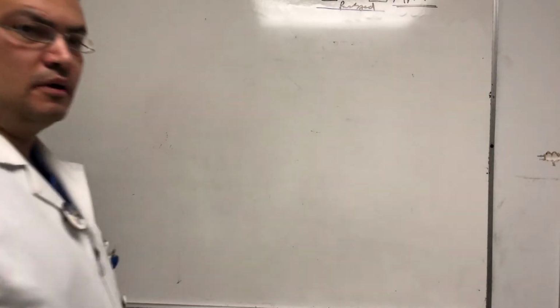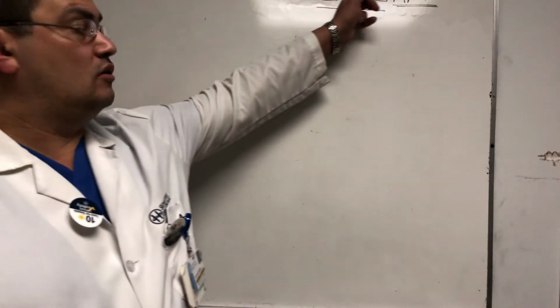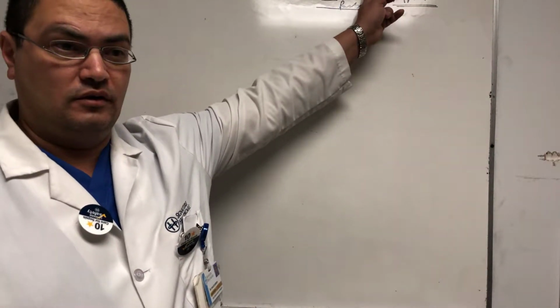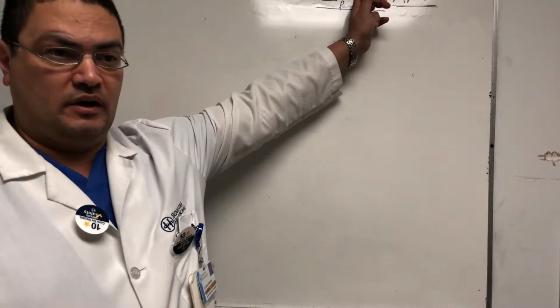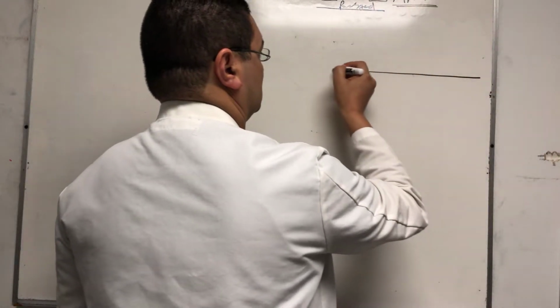So a day passes by, a second day passes by, and we're getting worried. We need to get the patient off the paralytic, right? But if we get him off the paralytic, he's going to be hypoxic. So what are we going to do? We need to get him off the paralytic and put him on a mode of ventilation that will give us a long inspiratory time like this, or even longer, without the need for paralysis. And hence comes APRV, and it looks like this.